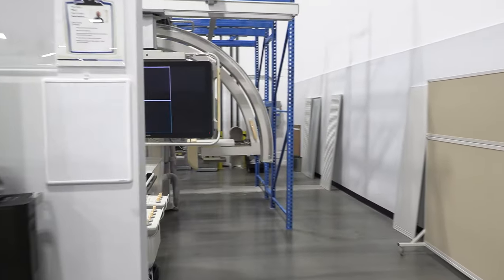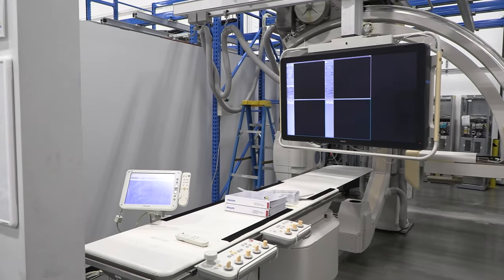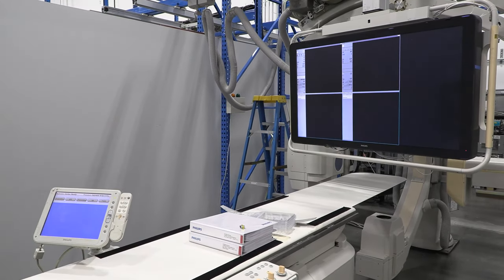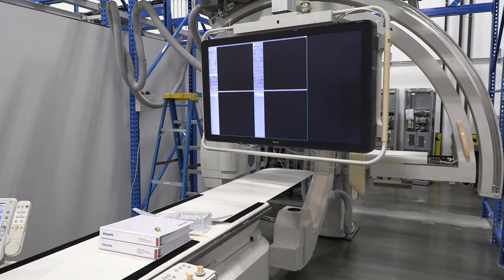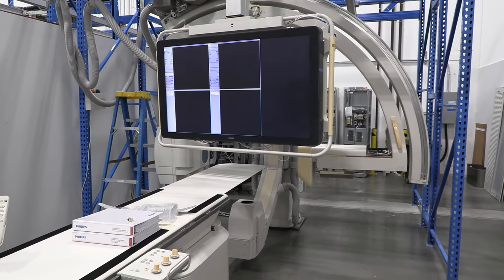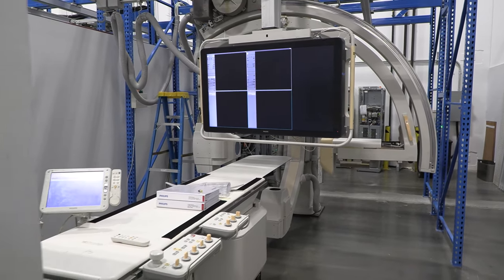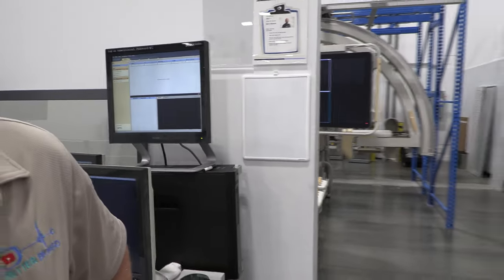I'm out in this building today, and this is where we also test all the large format monitors. Oh yeah, that's beautiful. So if there's a large format monitor that has an artifact or something in it, you can get it shipped in and repair the monitor yourselves. That's amazing. That's a huge monitor. Very expensive. It's all they want now. Nobody wants the 4-bond. No, definitely not.